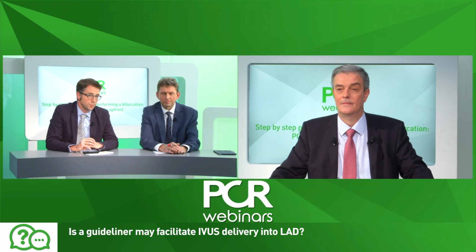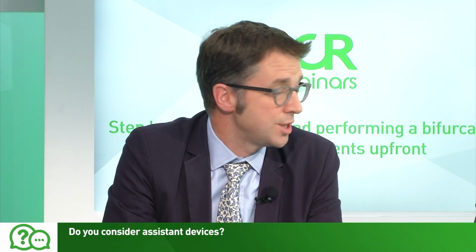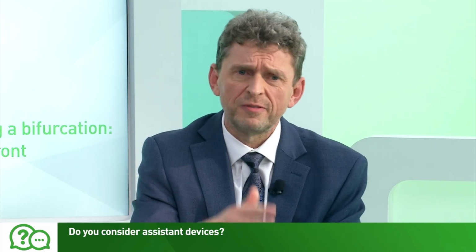Increasing the guide support may help. Do you consider an assist device? I think maybe probably Impella or... This was a moderately impaired ventricle, and actually the patient tolerated this procedure very well. Only if there is a really depressed LV function up front. So if you have a patient with ejection fraction like 15, 10, then you can consider. Never in this case. Yeah, so we already answered.